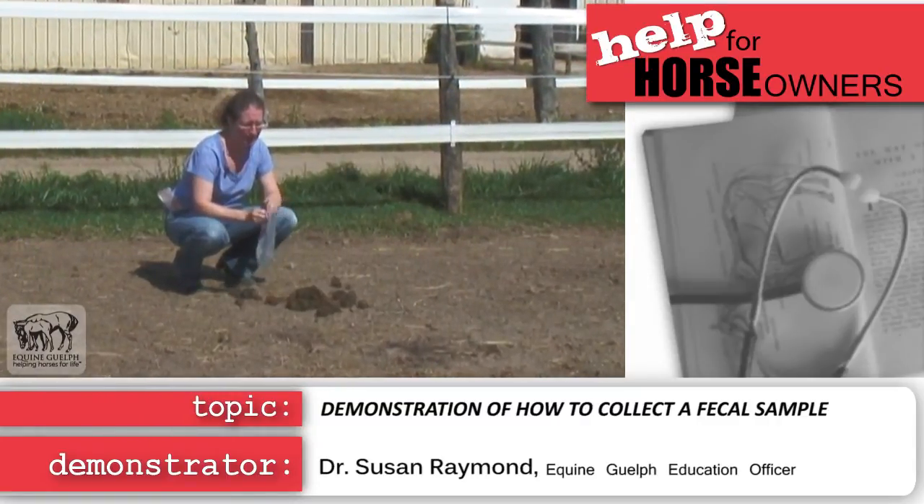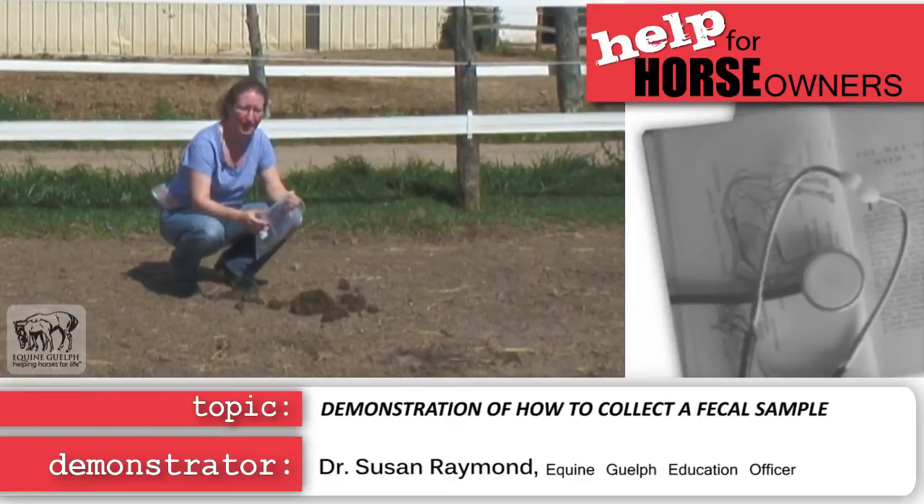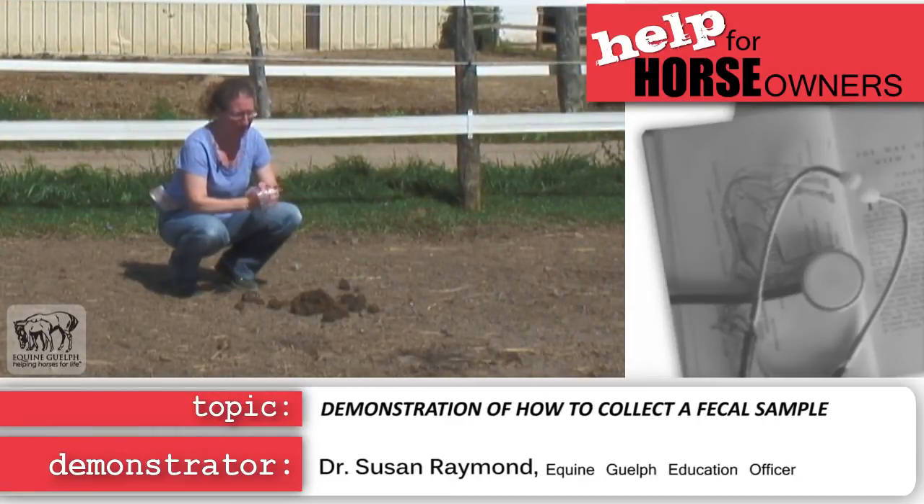Today we're going to be collecting a manure sample for your fecal egg count. You take a ziplock bag and put it inside out with your hand inside.